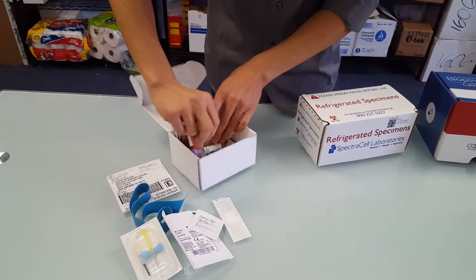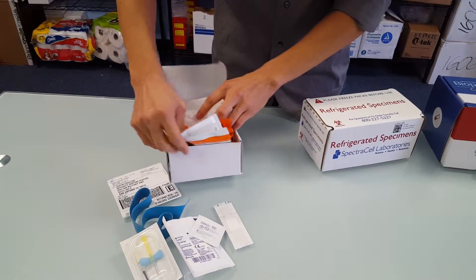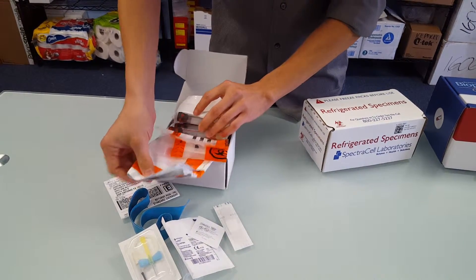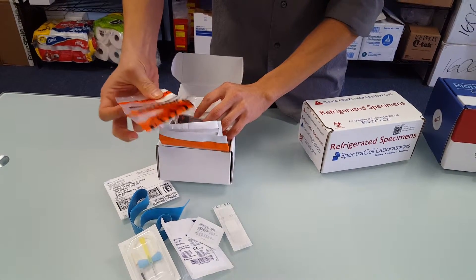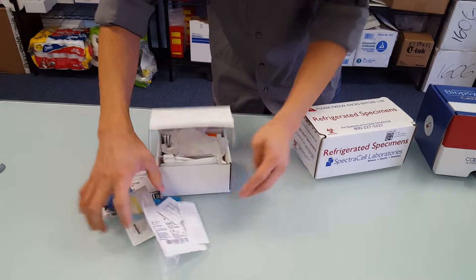An ice pick, there are some additional tubes here as well. Ice bag. Here we have the FedEx bag as well as the biohazard bag. Everything is nicely packed in here.